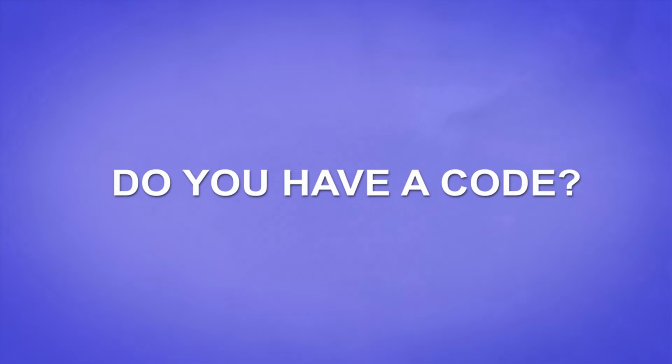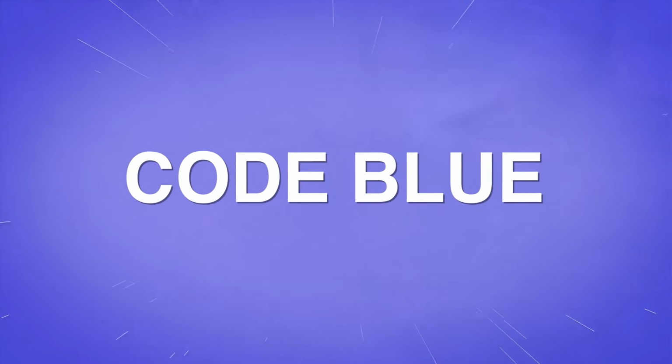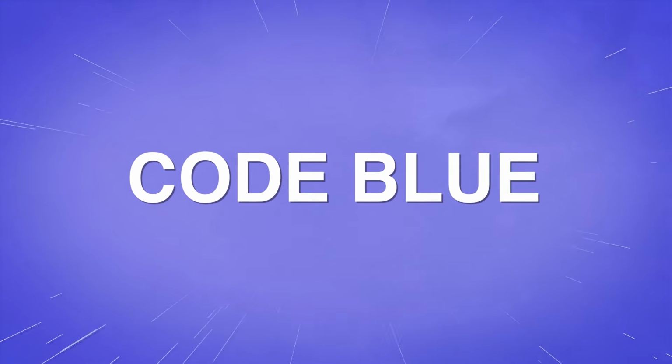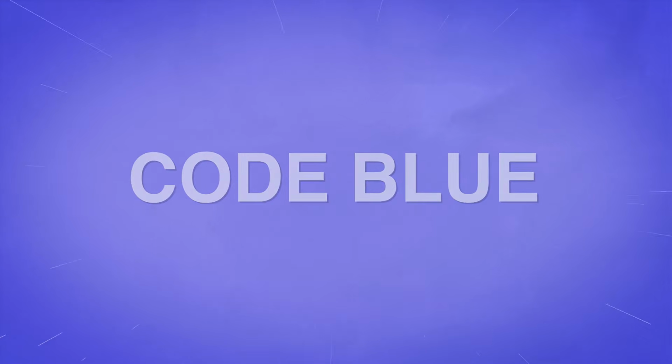Do you have a code? This code name will be used to initiate a response to a cardiac emergency by the Cardiac Emergency Response Team. The code should be communicated on the drill day and in a real cardiac emergency as defined in your communication plan.